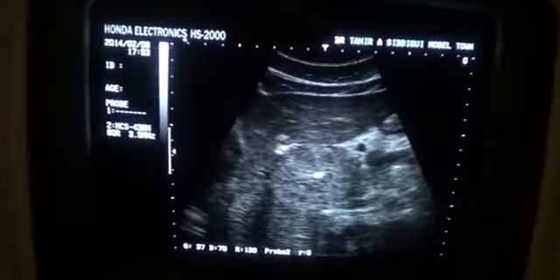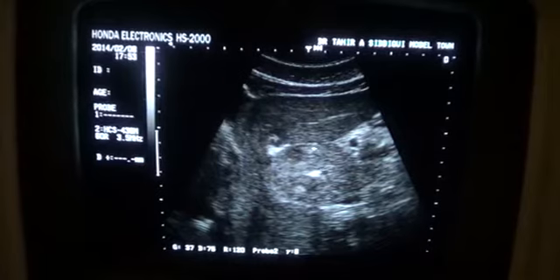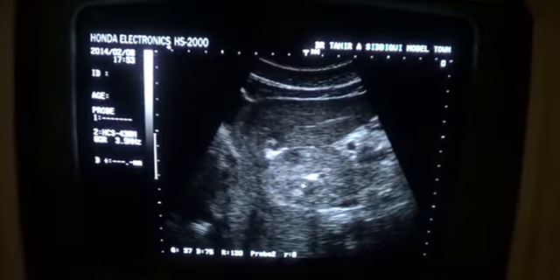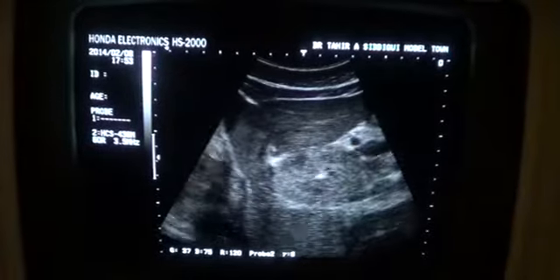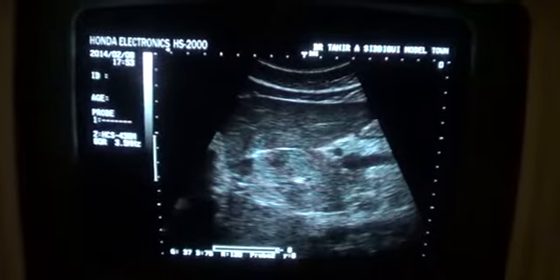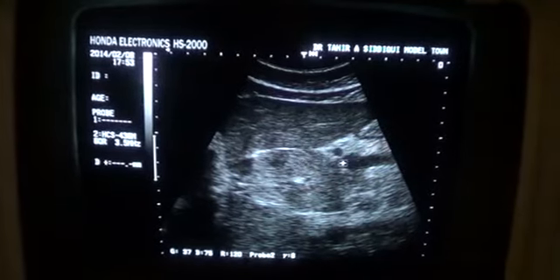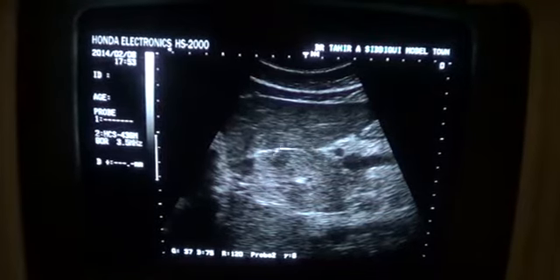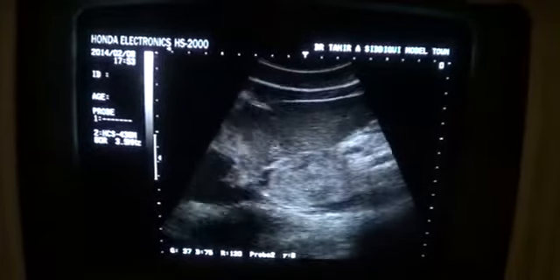This is a mass related to the caudate lobe of the liver. You can see a calcification is also seen within this mass, as the caudate lobe shows internal hypoechoic areas and echogenic areas. This is the longitudinal section. This is the portal vein. This is the common bile duct, calcification, hypoechoic area, ligamentum venosum, and this mass of the caudate lobe.